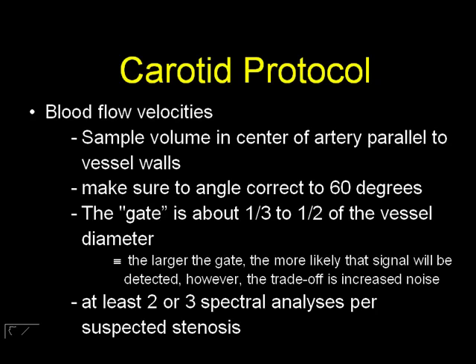In any case where you're using less than a 60-degree angle, I believe that it's appropriate to document which angle you're using. And again, this is particularly important in follow-up studies. If you're using anything less than 60, when you're doing a follow-up for comparison, you really want to make sure to use the same angle during that follow-up study.